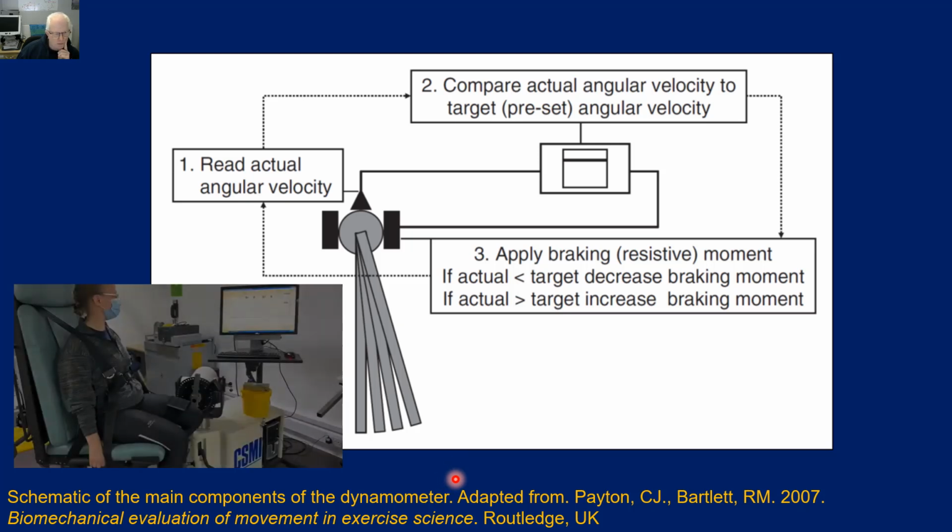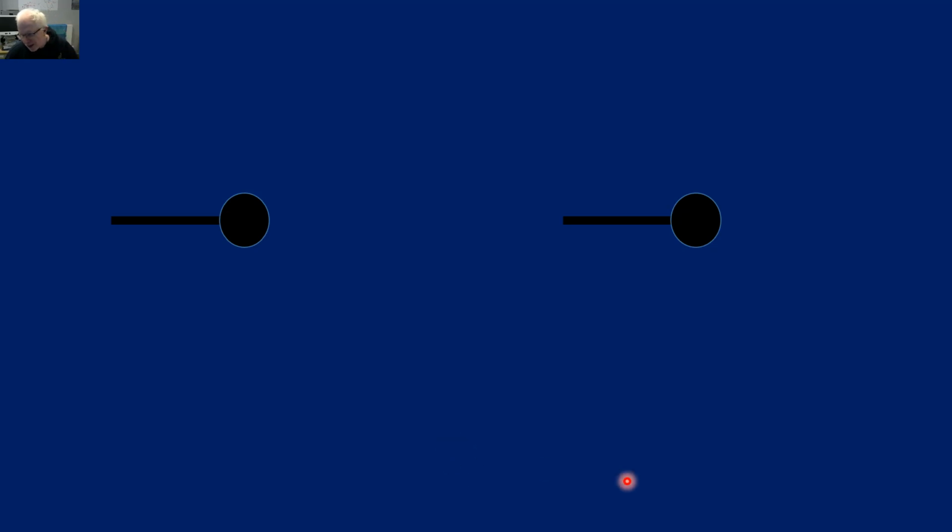So let's think about that perhaps in a slightly more simplistic way and explain what happens when we change the muscle articulation, the muscle action. So here we've got two examples. The black line here is going to represent for us the thigh muscle, and this is going to represent our knee joints, the articulation in both examples. We then have the tibia and the fibula, and then we have our foot.